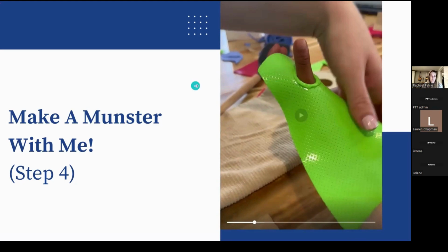So if you start like what we just showed, just make sure that the part that you rolled out is on the outside, not the inverse, not flipped in. So that's the one thing you have to be really careful about.